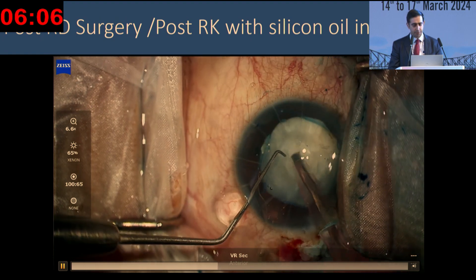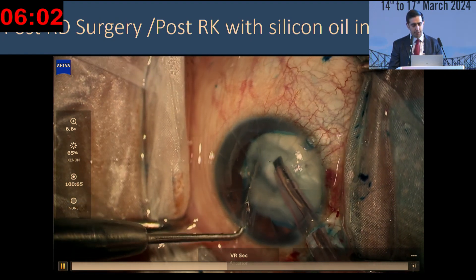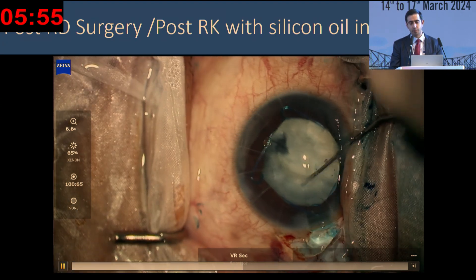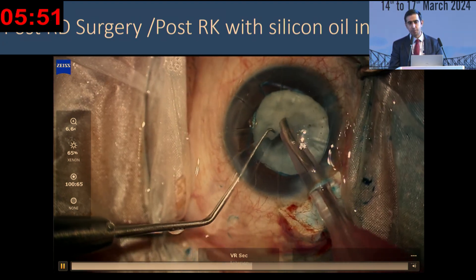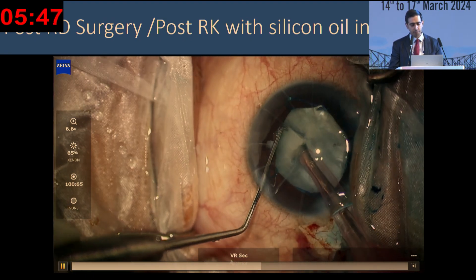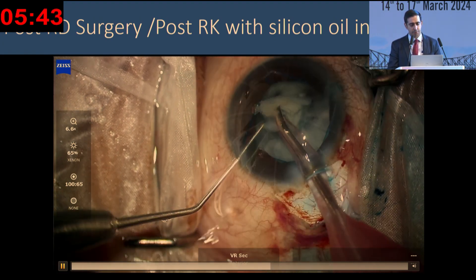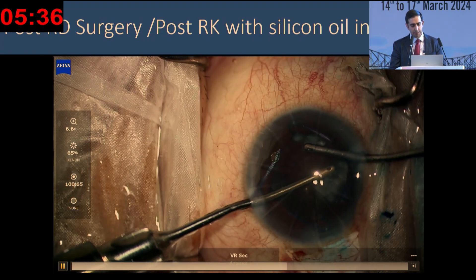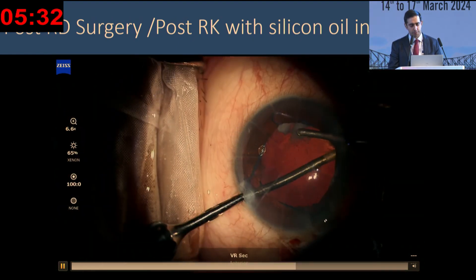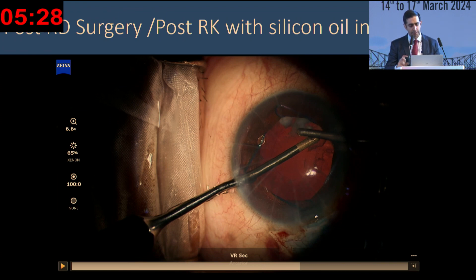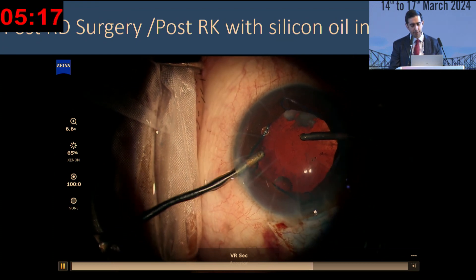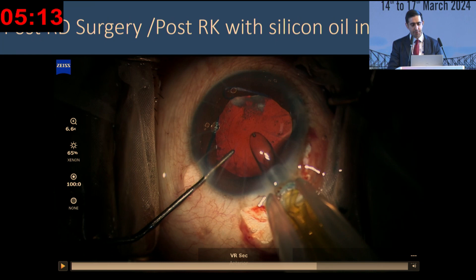A very careful hydrodissection and rotation was done. I'm sculpting to understand the brittleness of this cataract, using very low parameters — both for the fact that there are RK marks that I don't want to open up, and because the capsule is very small with a small flap on the side. Gently bringing out each of the pieces, then switched over to bimanual irrigation aspiration. Being careful because silicon oil was coming from the zonules, I used retro-illumination to improve visualization. The final bit of cortex is being aspirated; there is a bit of fibrosis on the posterior lens capsule.